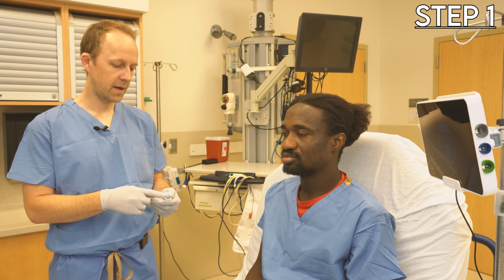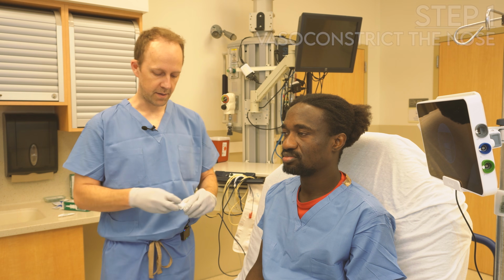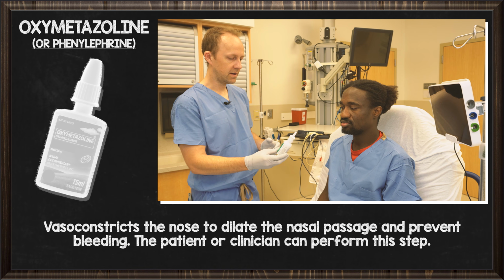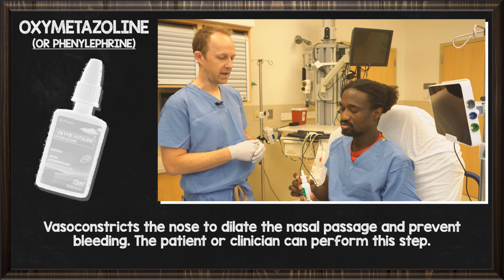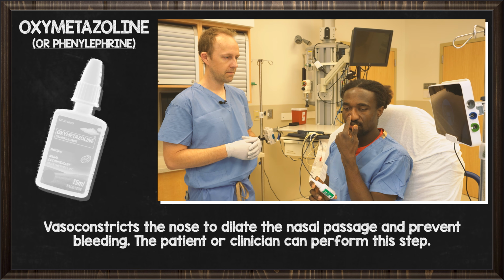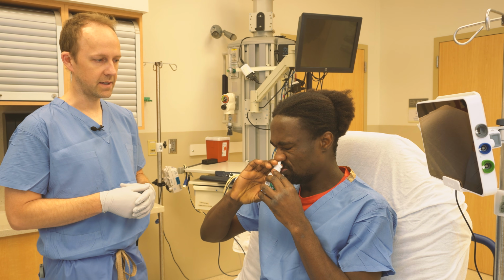All right, so the first step is to vasoconstrict the nose so that it opens it up, prepare it for tube passage. So this is oxymetazoline. You can use phenylephrine as well. You can either apply it or you can have the patient apply it into the nose they're breathing out of a little bit better. And you can be pretty generous with this oxymetazoline.